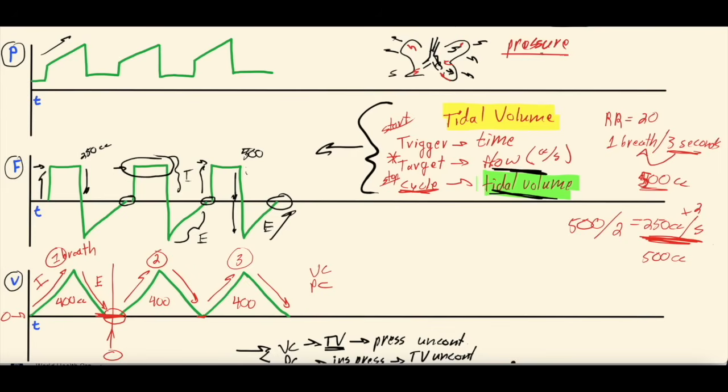And peak and plateau pressures and things is going to be a different video. But when you set a set flow rate, as it flows air down and pushes those lungs out, it's going to slowly build up an increasing pressure as more air is delivered into the lungs until you get to that point where the breath is done. You can see these line up, right?